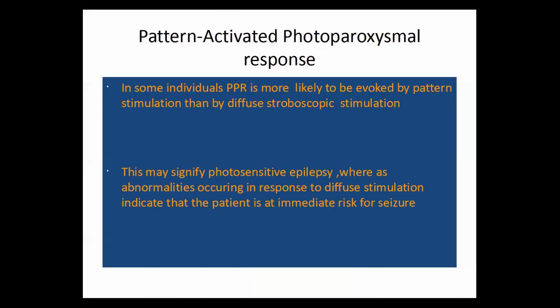Now, there is another thing which I want to emphasize today. It's a pattern activated photoparoxysmal response. This is something all our postgraduates should start doing in our day-to-day practice. You try to evoke the photoparoxysmal response not only by photic stimulation, but also by pattern activation. One thing I told you yesterday is the glossokinetic response, asking the patient to say la la la and looking for the response, which we should all start doing.